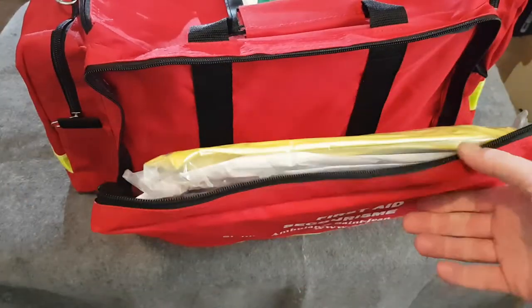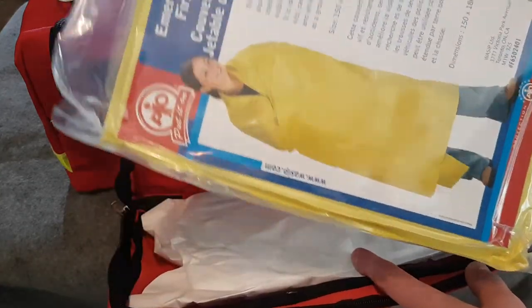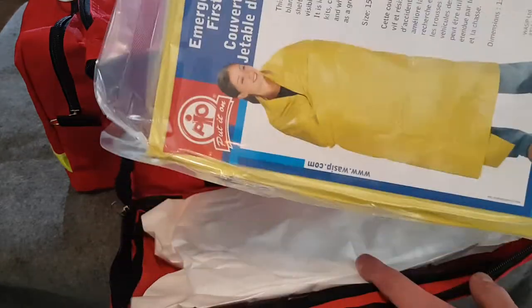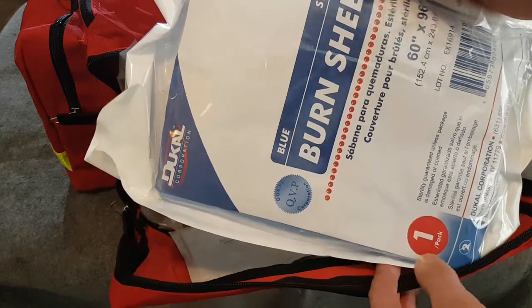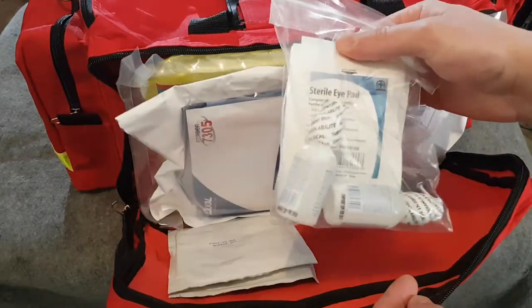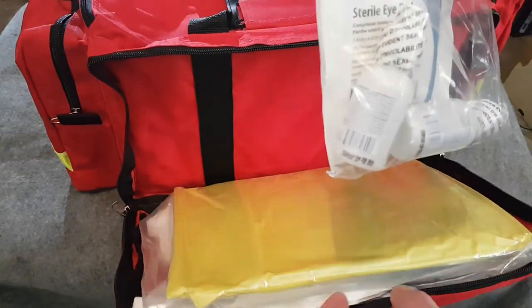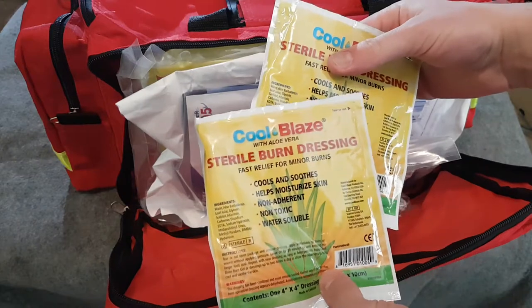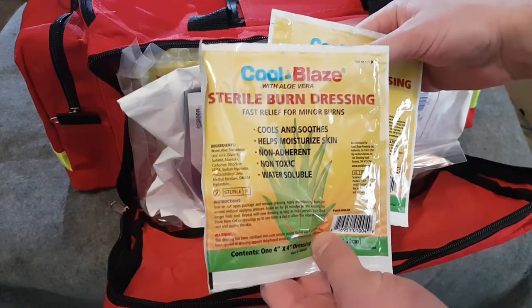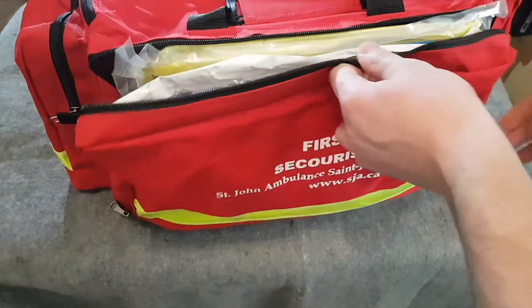In this front compartment we have an emergency disposable first-aid blanket — it's a wool-like material, similar to a fire blanket, for keeping a person warm. We have a sterile burn sheet for someone badly burned. An eye injury kit with eye wash and eye pads. Some Cool Blaze sterile burn dressings with aloe vera — two of those. And an emergency survival blanket.